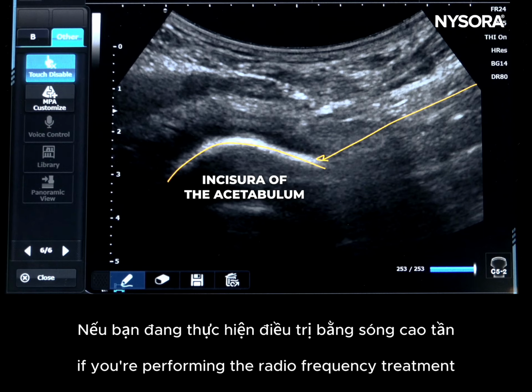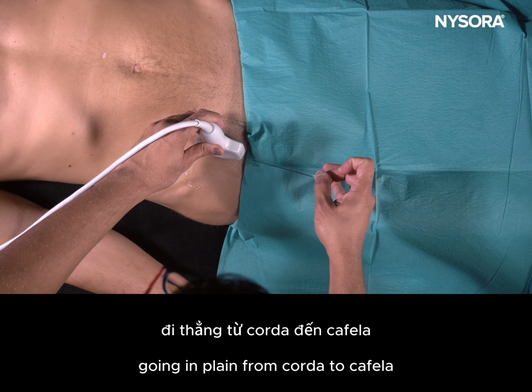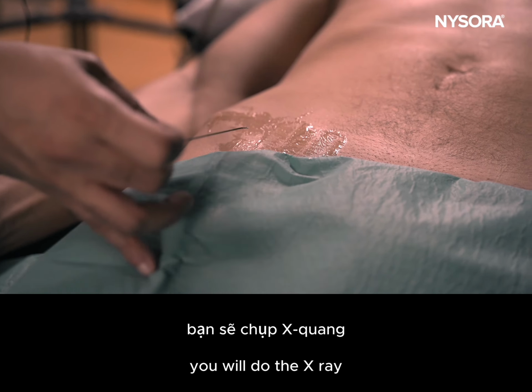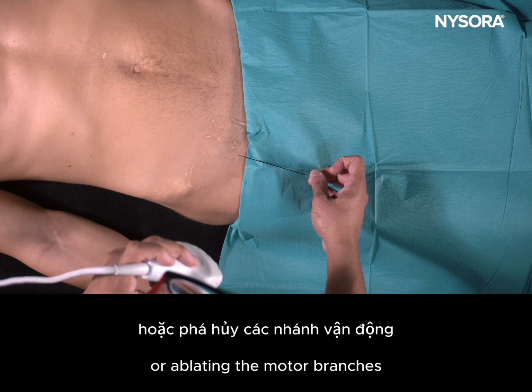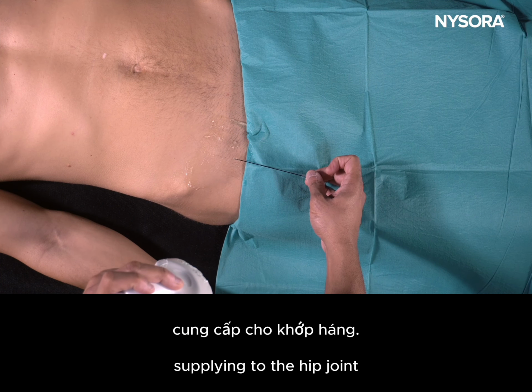If you're performing the radiofrequency treatment, the needle will be brought in a similar fashion, going in plane from caudad to cephalad, and once your needle is in position, you will do the x-ray. You will perform motor stimulation in order to prevent blocking or ablating the motor branches, and only ablate the articular branches supplying the hip joint.